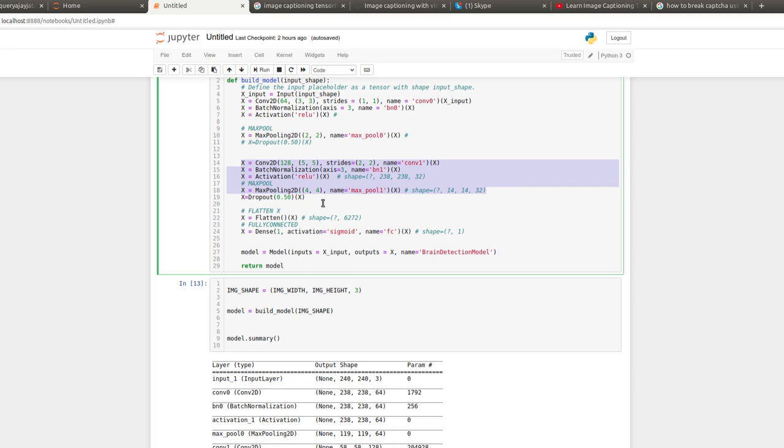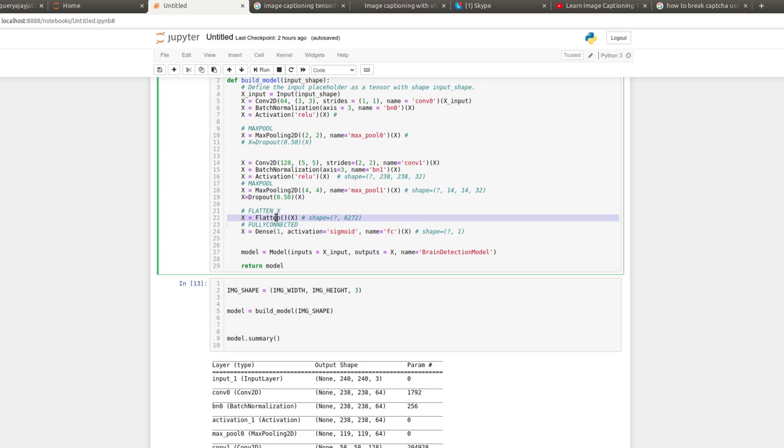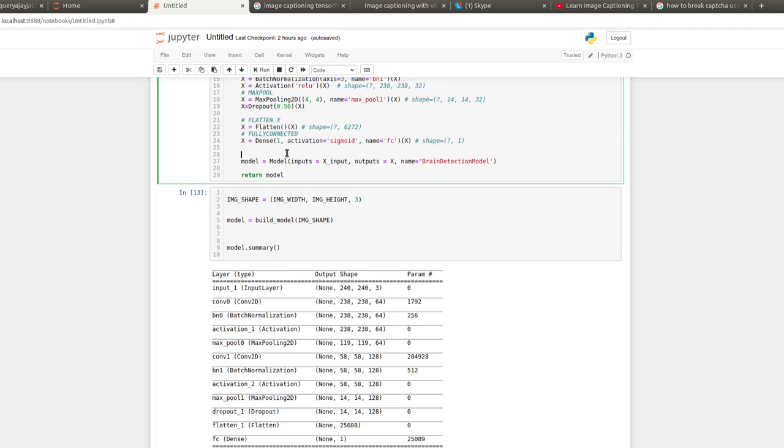the model is compiled. The input of the model is the image and the output is binary classification. Here, this is the network architecture. You can see the loss I have used is binary cross-entropy, the optimizer is Adam, and the metric is accuracy.